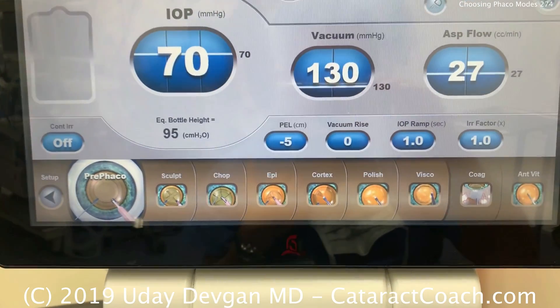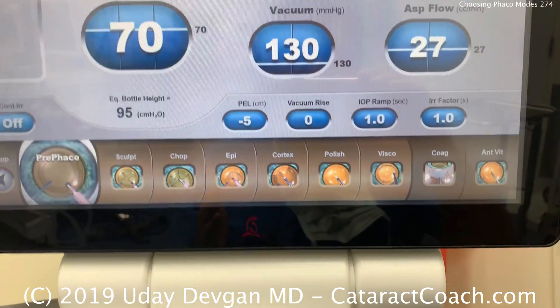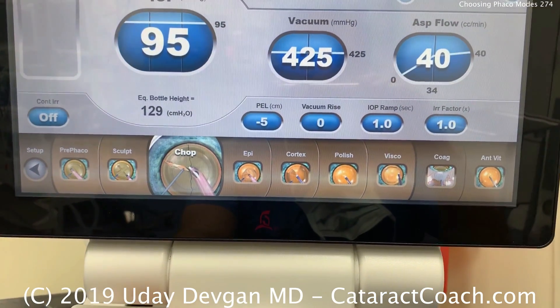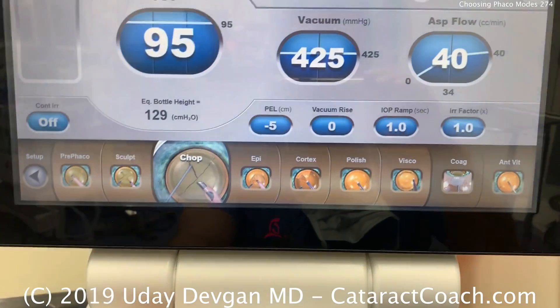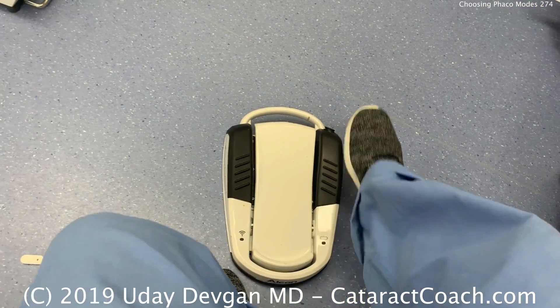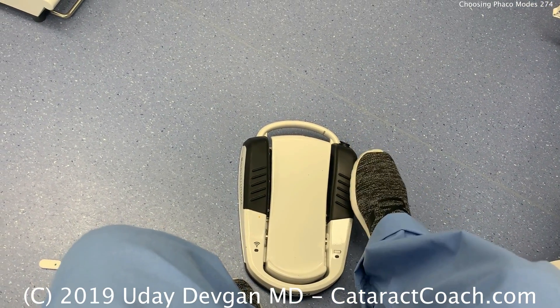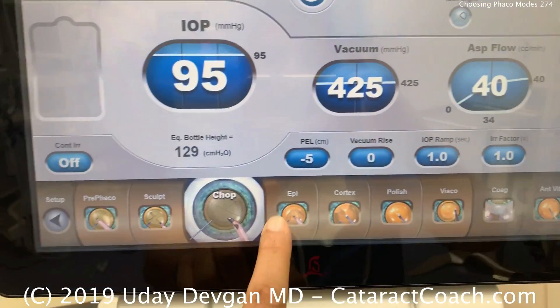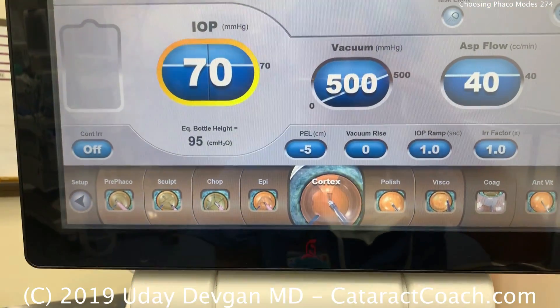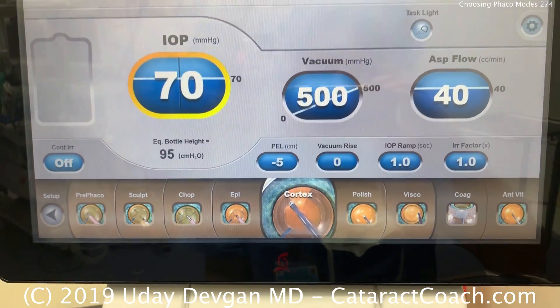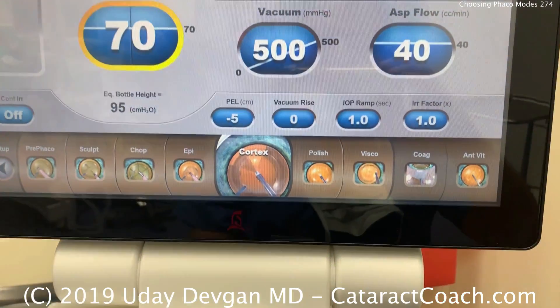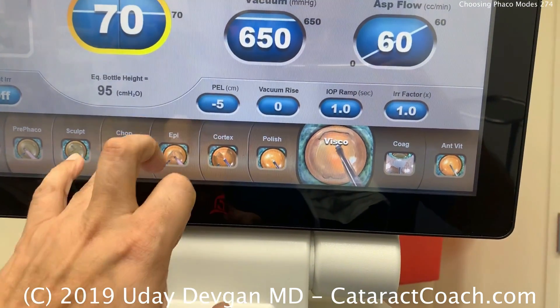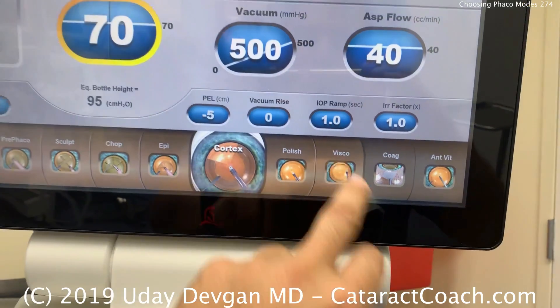In my normal settings in my OR, I don't use all these settings — I use three. I use CHOP at the beginning of the case. I double tap my pedal on the side to change the mode, tapping it twice to go to Cortex. Then I remove the cortex. At the end, to remove the viscoelastic, I double tap it again, and it goes to viscoelastic removal. So that's my normal: three things — CHOP, Cortex, viscoelastic removal.